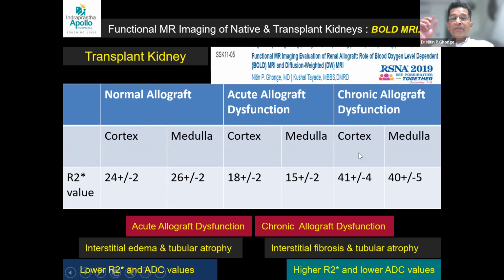So what I mean to convey is that BOLD MRI is an important component of functional MR studies, which is now coming up in a big way and is likely to evolve further. Right now, the closest non-invasive imaging option to diagnose CKD or to prognosticate the progression of CKD is color Doppler based RI values, but RI values have significant overlap and a lot of gray zones.